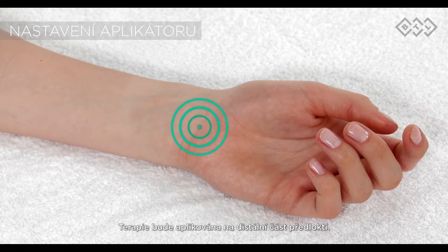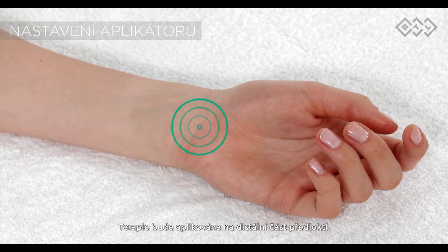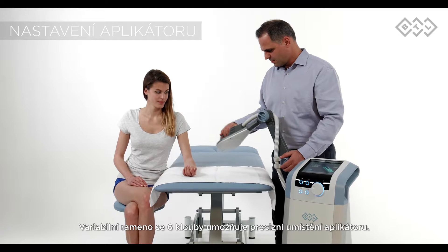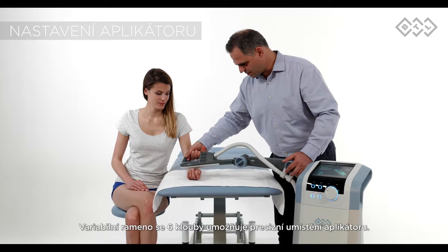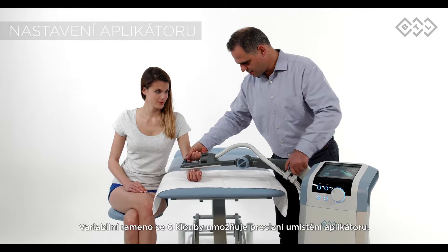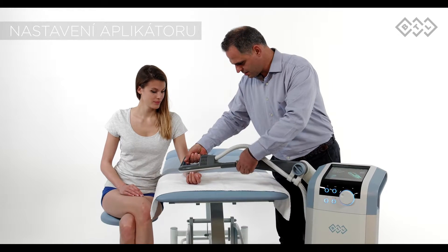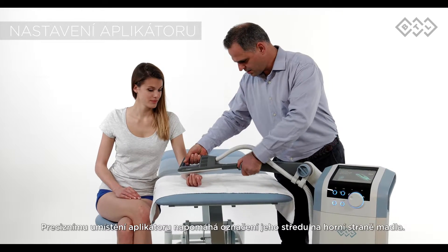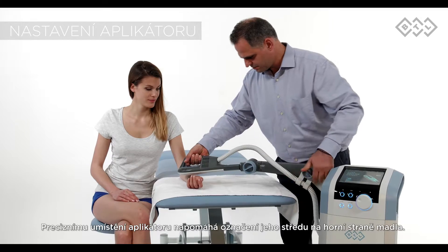The therapy will be delivered on the distal part of the forearm. The six-joint arm of the superinductive system allows precise placement of the applicator. Follow the indentation on the top of the handle to place the center precisely.